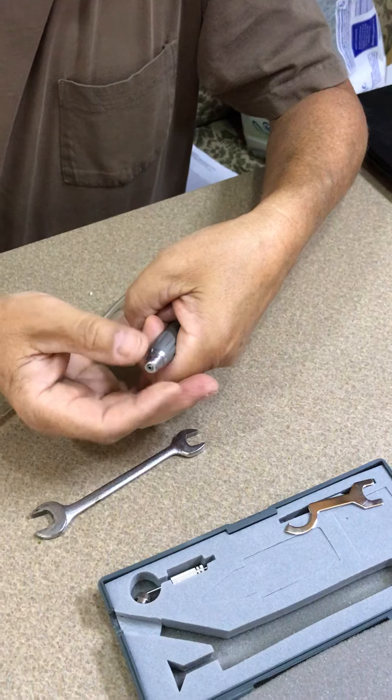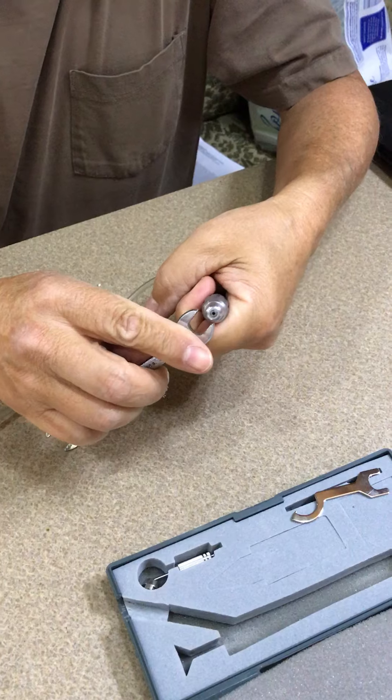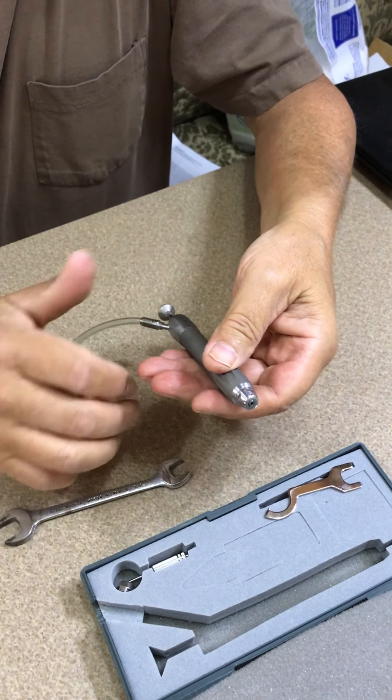Get it started and screw it in hand tight, then take your wrench and tighten it up — and that's it, that's all there is to it. Good luck!